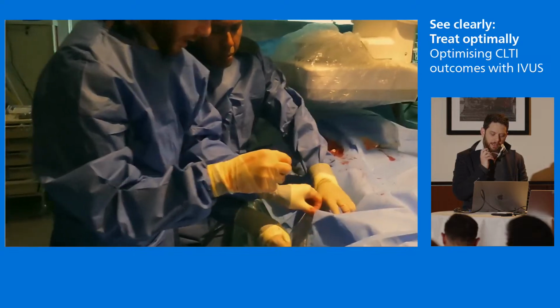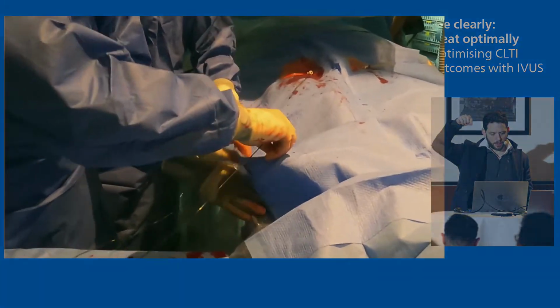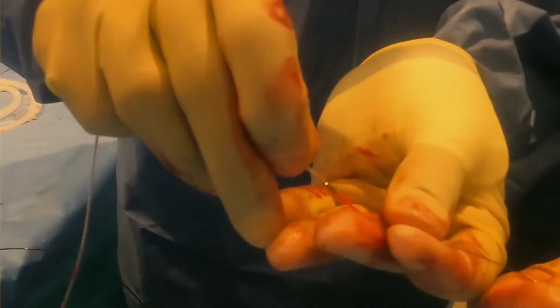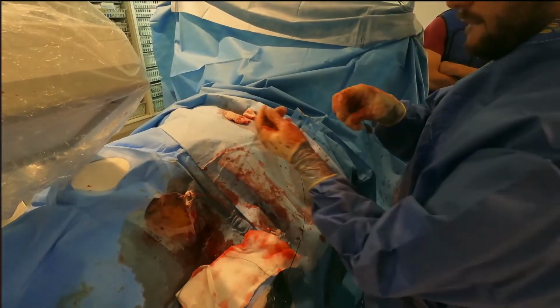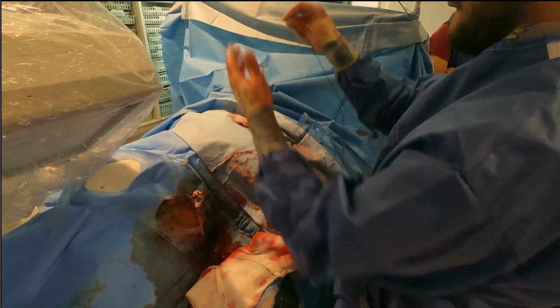And this is how we set up the actual PIM connector. We pass it through a hole in the sterile drape and then plug it into that PIM connector. This is the 018 catheter going on here. So this is an over-the-wire 018. It's got a red tip, and this is a different case, but me doing the same thing here with an 014 monorail.